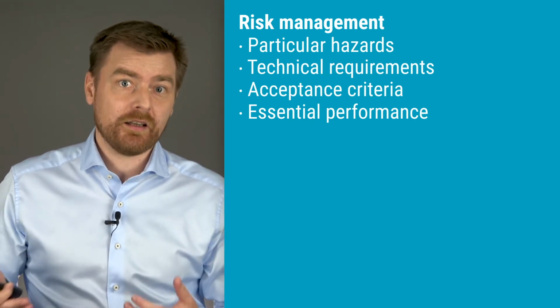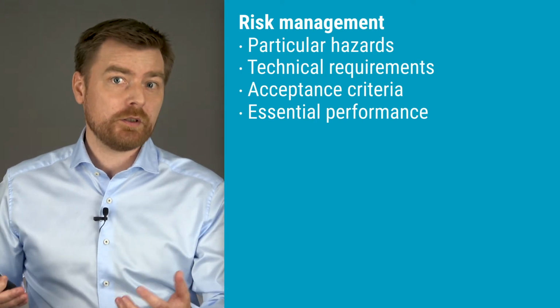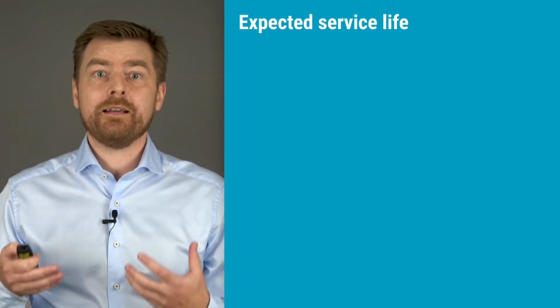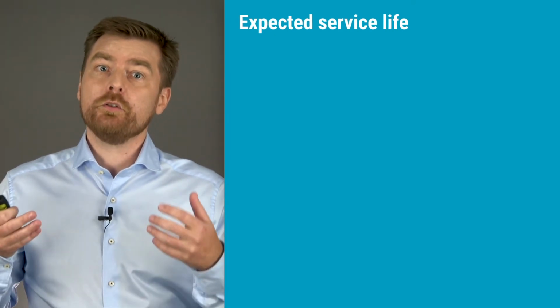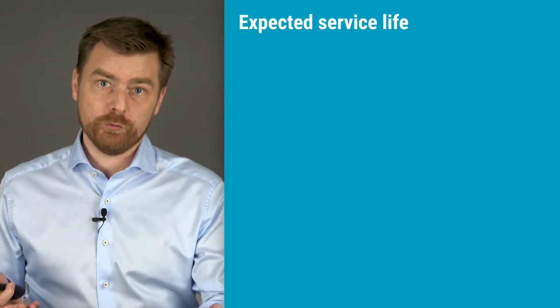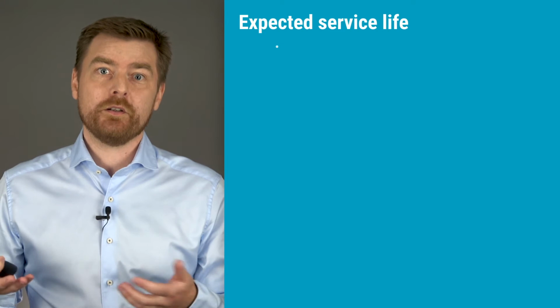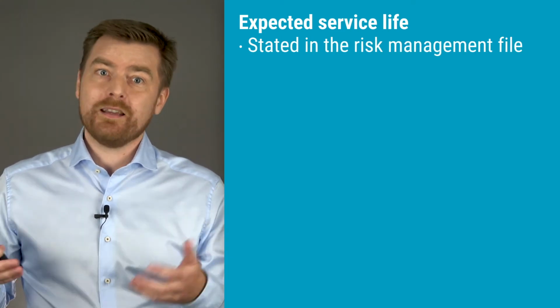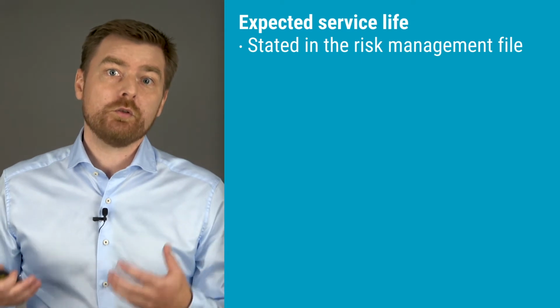This analysis shall include performance limits for relevant functions. The expected service life is defined as the time period during which you expect the device to remain safe for use. This time period shall be stated in the risk management file, though there's no specific requirements to justify it further.